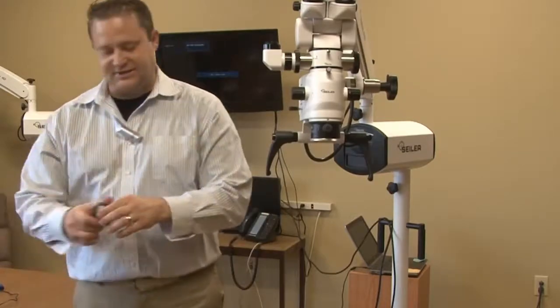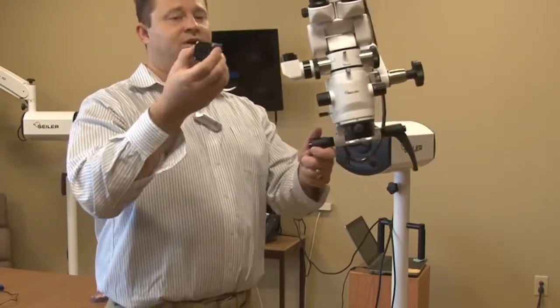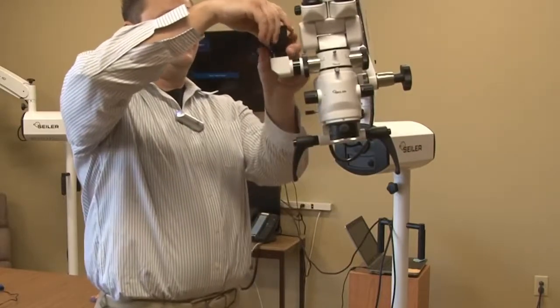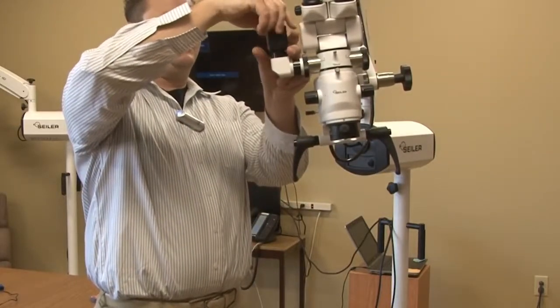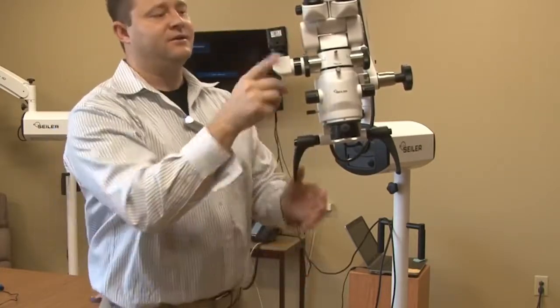Now I've got my 1080p HD camera. All this does is you're going to go ahead and thread that onto the adapter.